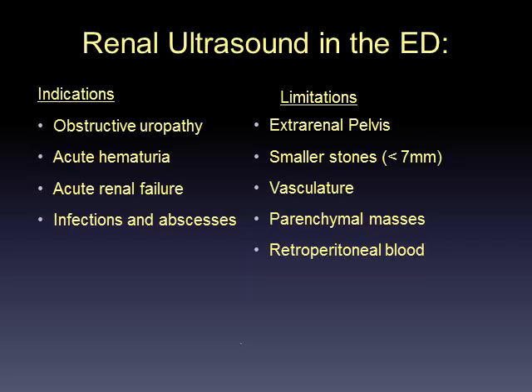With experience, it may be used in the assessment of acute hematuria in patients with renal failure and in identifying abscesses and infections. With experience, more global assessment of kidney function can be made using Doppler flow and so forth. However, that's probably best used to the experienced and advanced user.